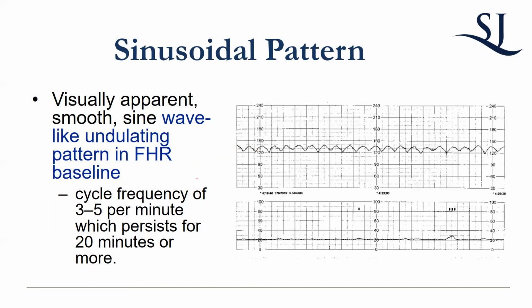Fetal anemia being, the best way I could kind of understand this, that if a baby has ongoing inadequate blood flow to the point where it actually is becoming anemic, you'll have a pattern like this. But to see this would mean you would have to see that happening before there was a problem. And because monitoring is so good these days, you usually don't see this. That's why we don't really ever see it.